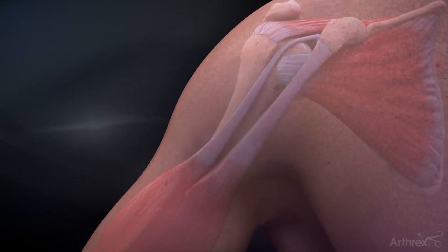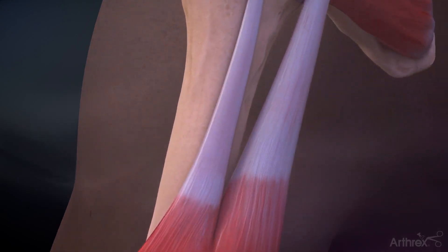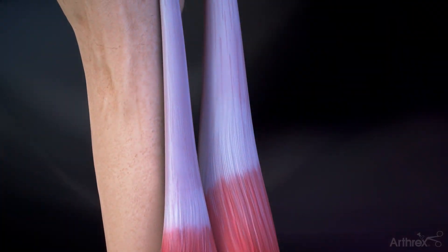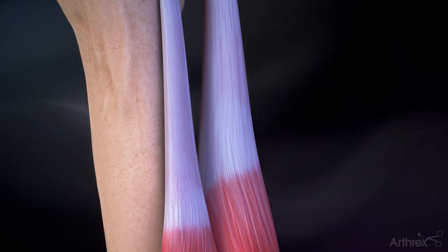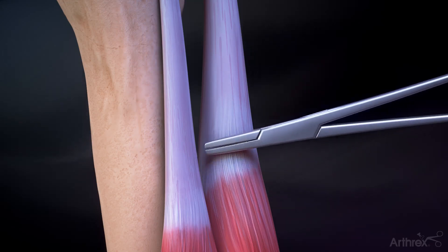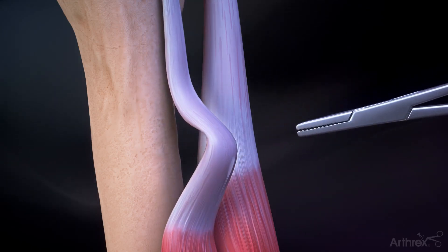Make a 2 to 3 centimeter incision in the axilla at the inferior border of the pectoralis major. Bluntly dissect to identify the pectoralis major and the long head of the biceps tendon. Retrieve the previously tenotomized biceps tendon through the incision.